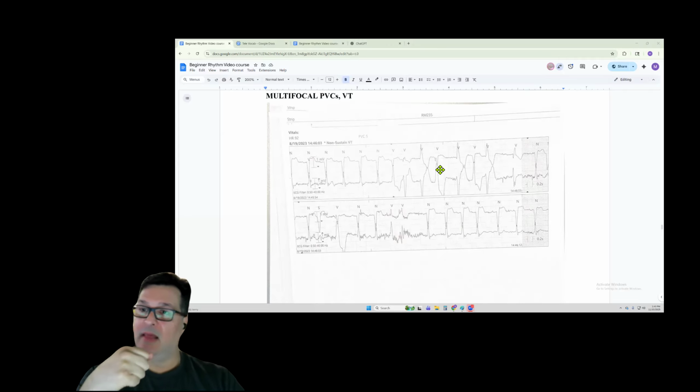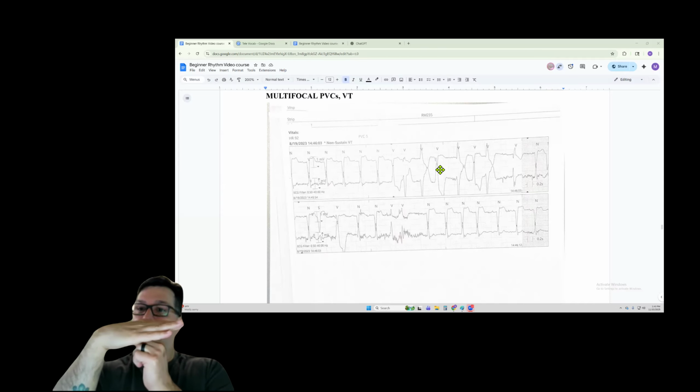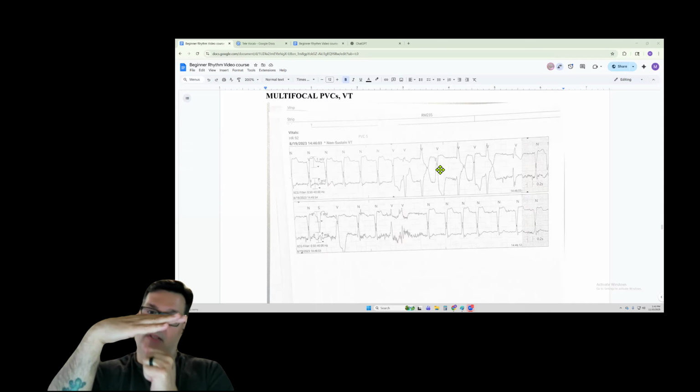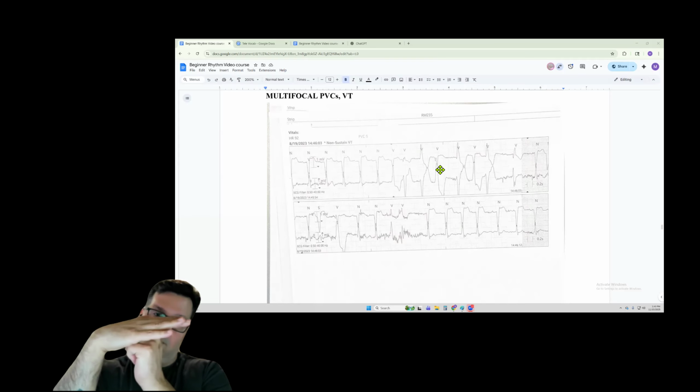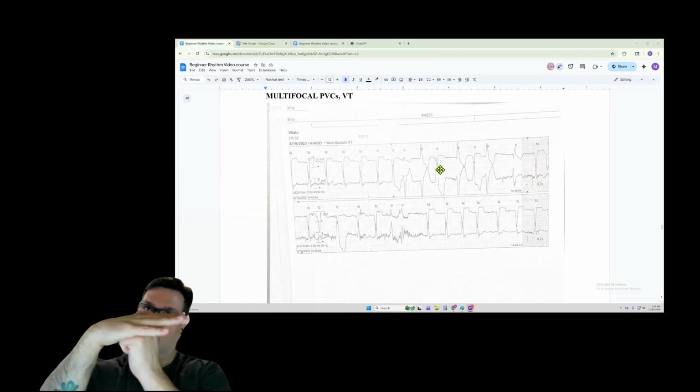And it's really about the brown V lead that we're talking about, on how if it's coming from the left ventricle, it's moving away. No, actually, sorry, it'd be going towards the brown lead, so it's creating a positive action. So where the right ventricle is depolarizing away from the brown lead and moving away.